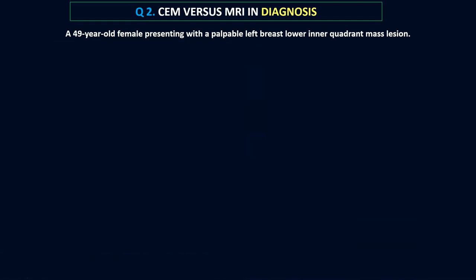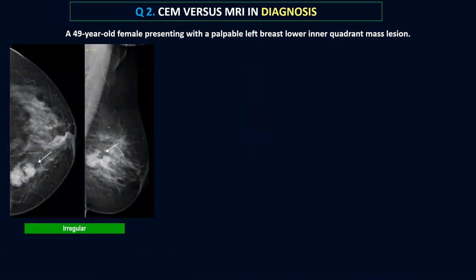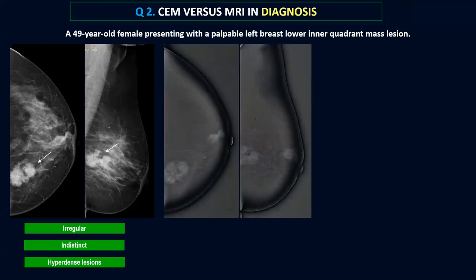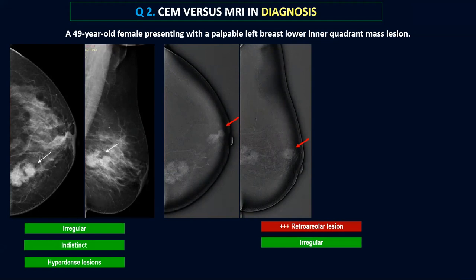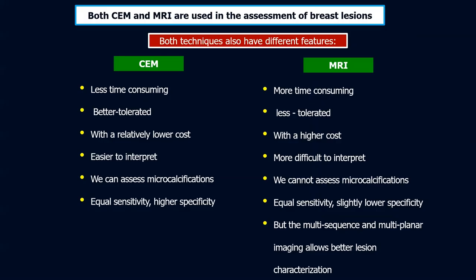A 49-year-old female presenting with a palpable left breast lower inner quadrant mass had two contiguous-adjacent mass lesions on her mammogram — irregular, indistinct, hyperdense compared to surrounding parenchyma. The contrast mammogram unfortunately showed an additional lesion in the retroareolar region. The lesions were described as irregular, non-circumscribed, showing heterogeneous enhancement. The MRI of the same patient used exactly the same descriptors, confirming that contrast mammography and MRI use the same morphological framework.